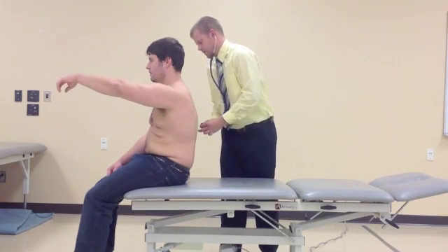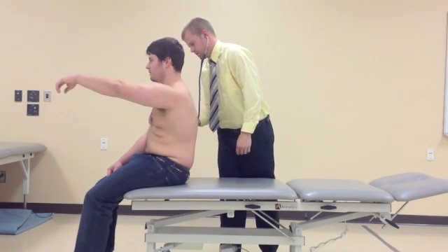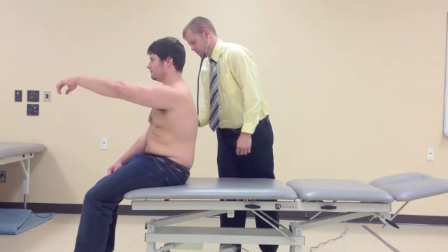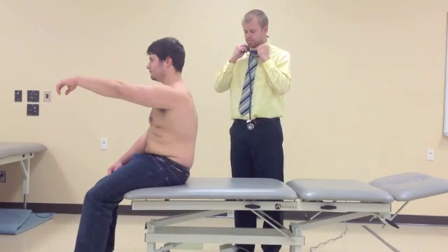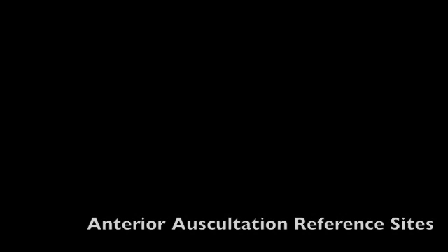The patient's arm is raised for ease of view in this video, but may be rested at the side. Once again, check your patient for lightheadedness or dizziness before moving on to anterior auscultation.